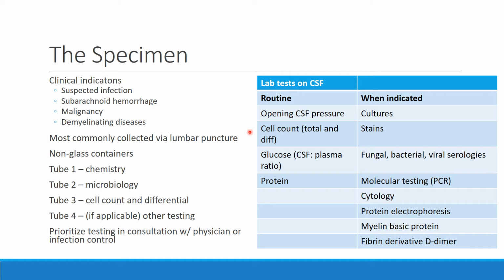Definitely have to have a cell count. Total cell count plus diff. We don't do one or the other, we do both. If you have cells, then you differentiate them. Okay, so we do that on each one.